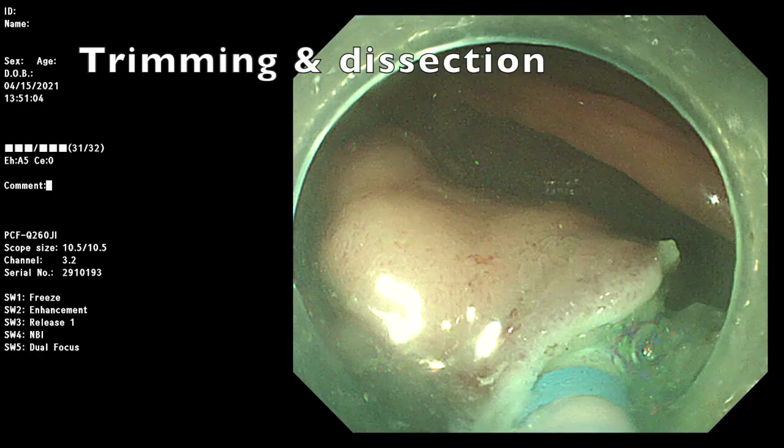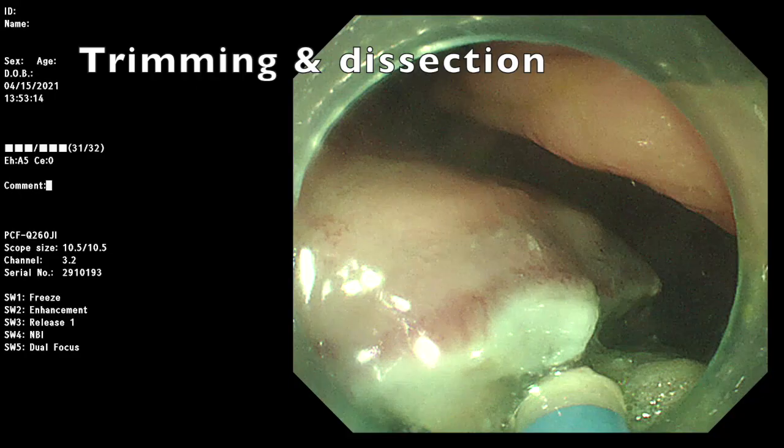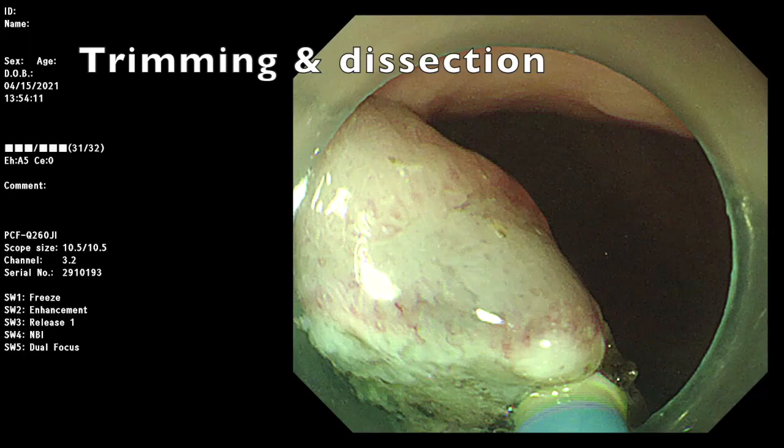Then we extend the mucosal incision, allowing us to use the approach to advance the dissection smoothly. Once the submucosal plane is accessible, we are able to extend the mucosal incision further.